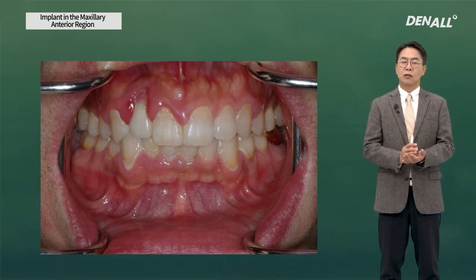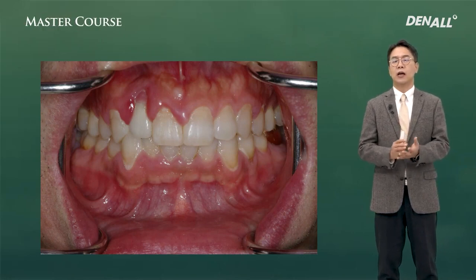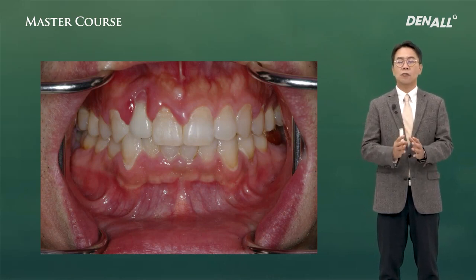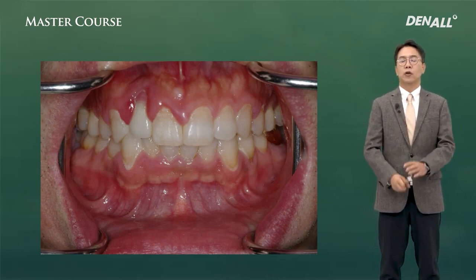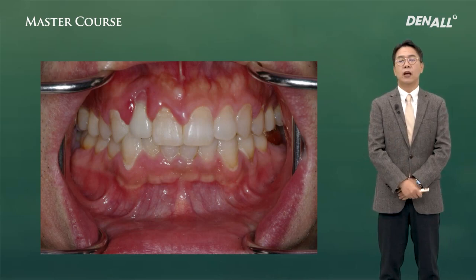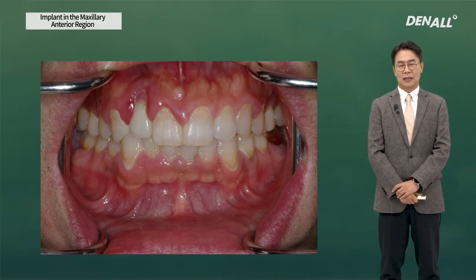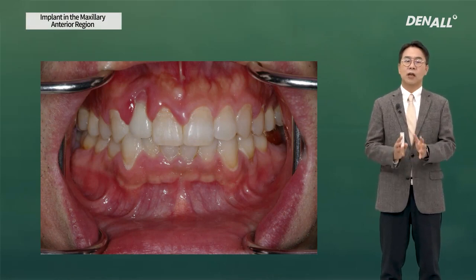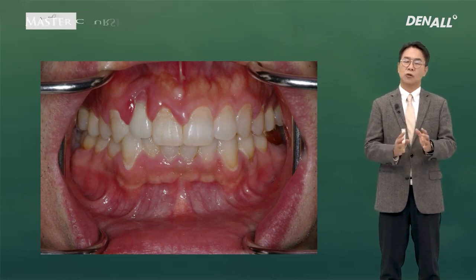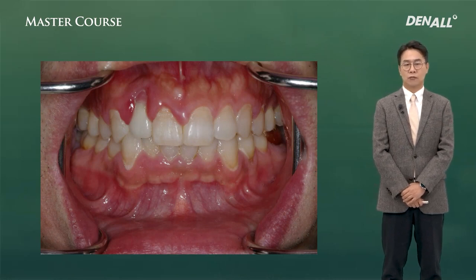I believe the doctor did the surgery after considering, for example, the implant placement depth and the surrounding bone and soft tissue before the surgery. I believe the doctor tried to make the outcome as similar to the natural tooth as possible. But I still think the pre-op preparation was not good enough. So I think, to make up for that, another prosthodontic approach was used. However, at a glance, you can easily say it is far from being aesthetic.